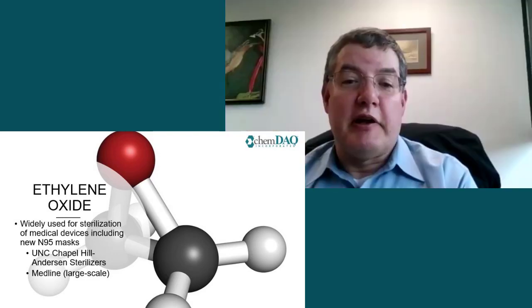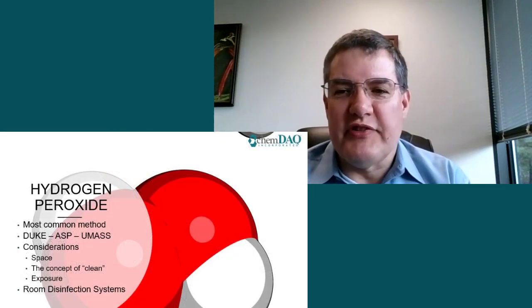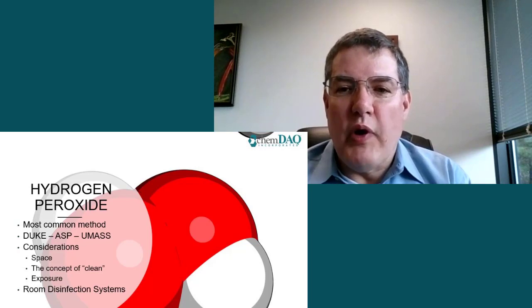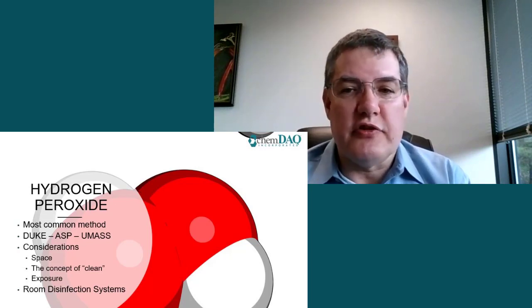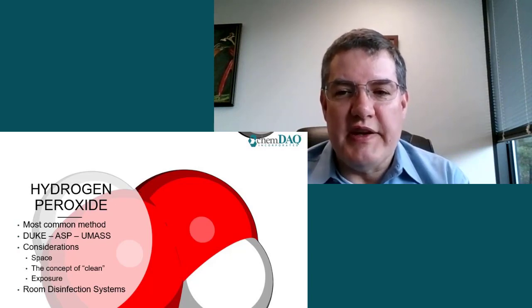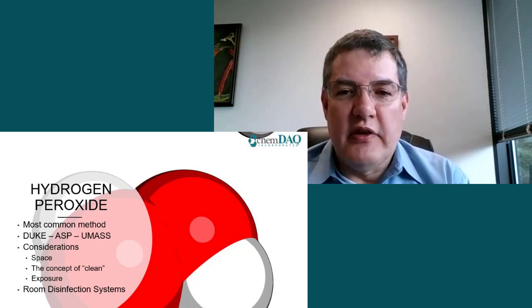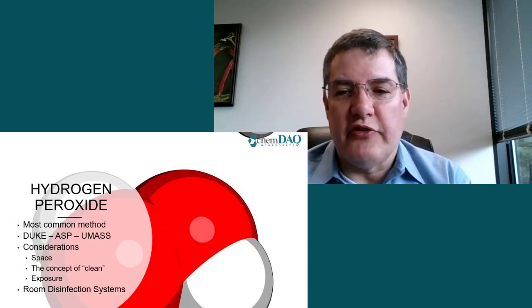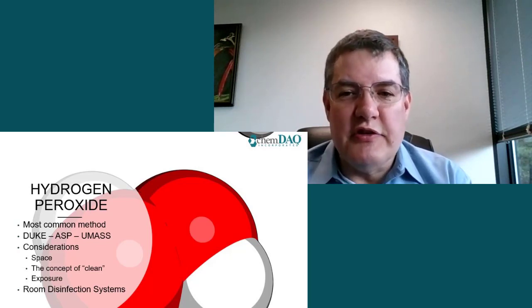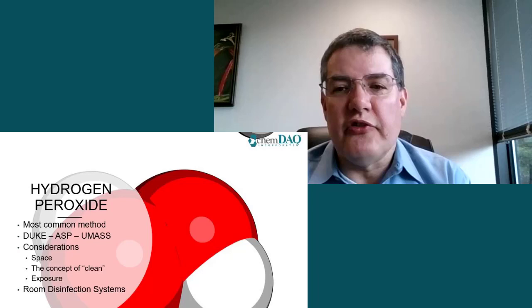Yes, Bob, you're absolutely correct. Hydrogen peroxide is the most common method of low temperature sterilization used in hospitals in the US. And hydrogen peroxide is widely used for whole room disinfection too. There are two approaches to hydrogen peroxide disinfection of N95 masks. The first uses a hydrogen peroxide sterilizer, and the second uses a room disinfection system. Sterilizers have the advantage that they are an established technology, but they can typically only reprocess small numbers of masks.